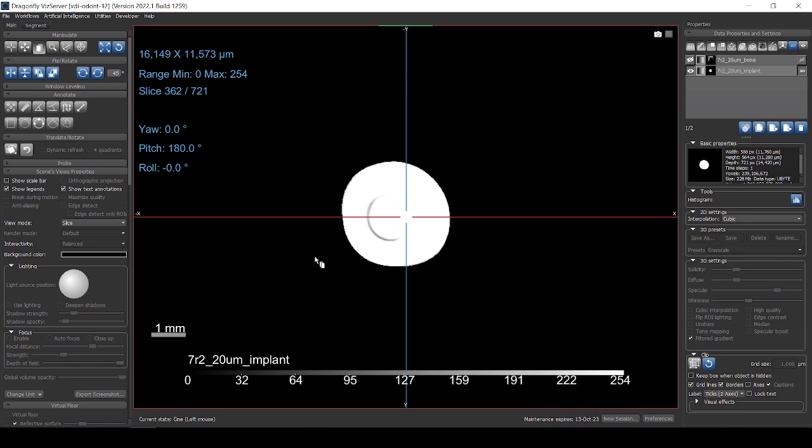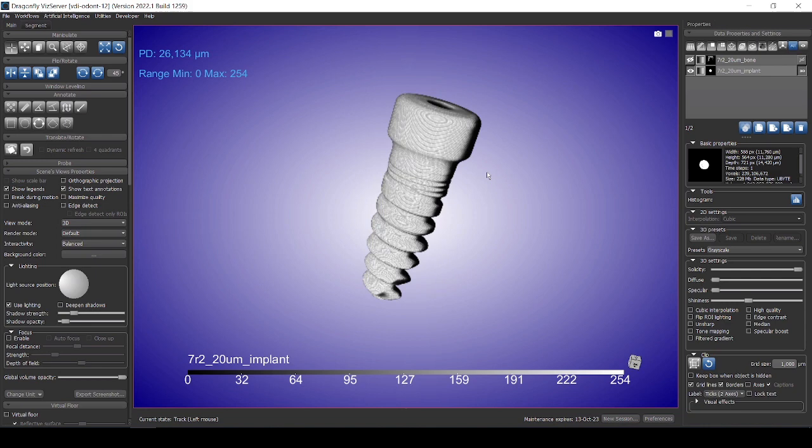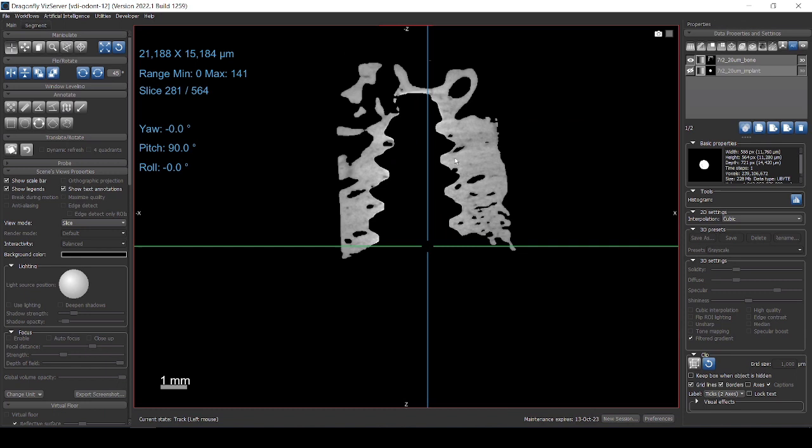So I have here an example. It's separated, the screw is separated here, so this is actually the implant. You can have a look more or less how it looks like. And we have also the bone, so I can show you here. So they are separated.